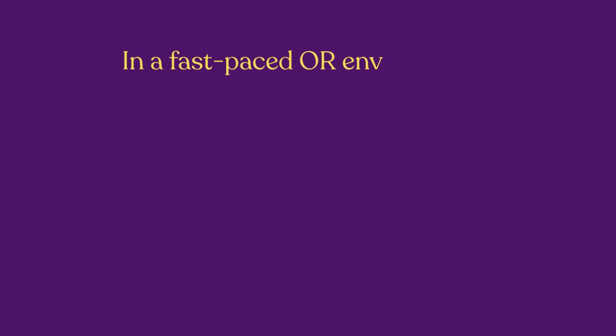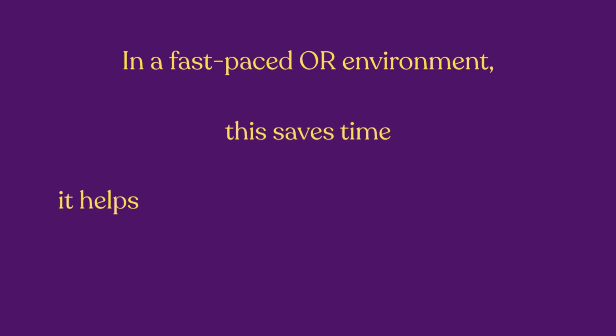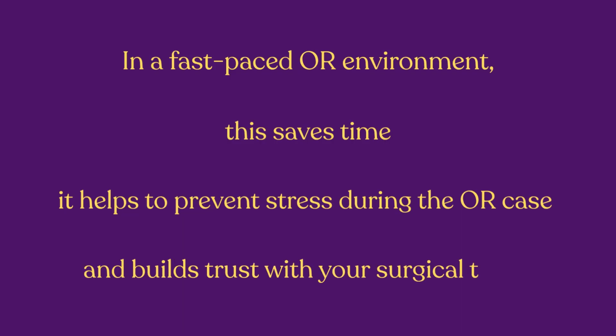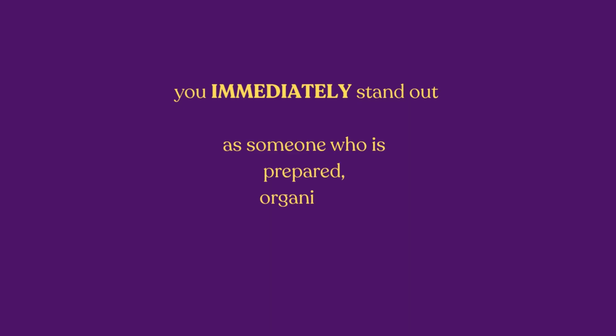In a fast-paced OR environment, this saves time, it helps prevent stress during the OR case, and it builds trust with your surgical team. In the OR, everything moves quickly, so having this done ahead of time helps you to stay calm, organized, and in control. If you master this step early, you immediately stand out as someone who is prepared, organized, reliable, and ready for the OR. If you only focus on one skill from this video, make it this one.